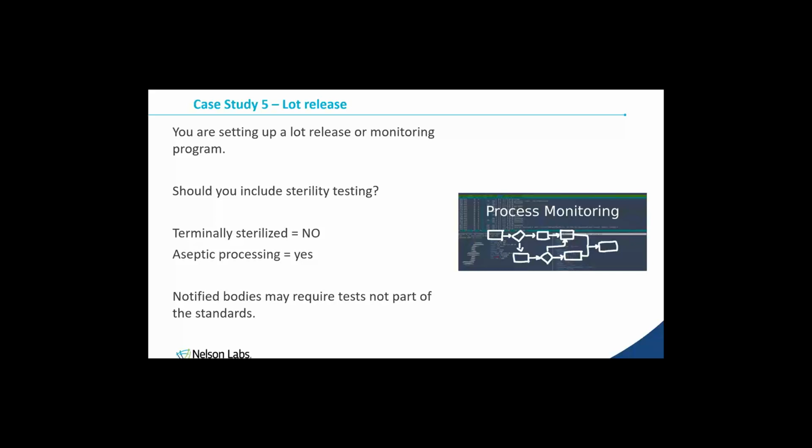So in a lot of situations, if you have that positive, it might mean you've thrown away the whole batch for something that isn't necessarily a requirement to do. So what you're really saying is, it's up to you. It's up to you if you want to just run the tests to get it through. We're not going to judge.